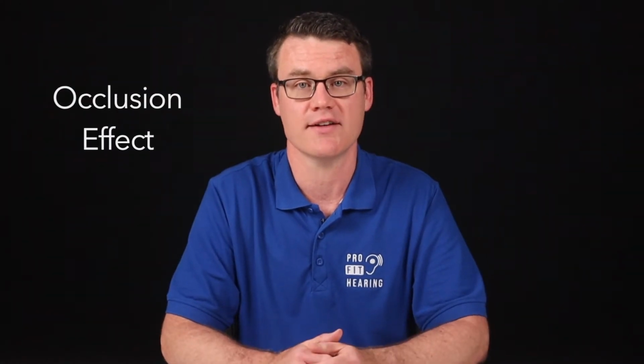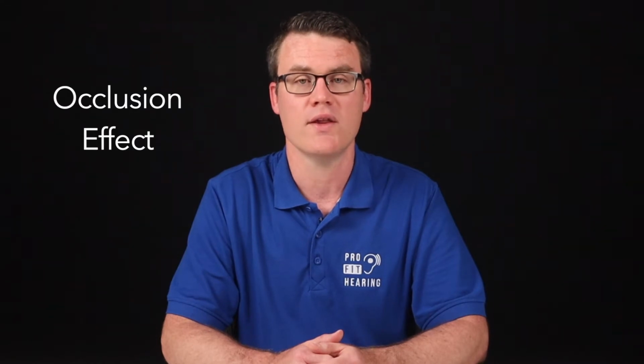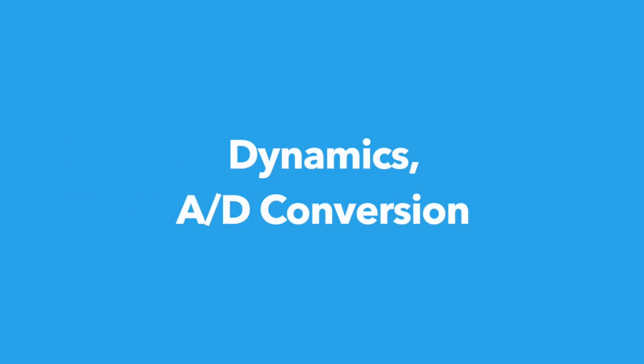Number 1, physical fit. First, consider the physical fit of the hearing aid. If your voice is too loud or booming when you speak or sing while you're wearing hearing aids, you may need an adjustment to minimize the occlusion effect. The occlusion effect results in an unnatural quality of your own voice when the ear canal is partially or completely occluded by a hearing aid. This effect can be minimized by switching to a smaller, less occluding earpiece or with an adjustment to the hearing aid's frequency response.